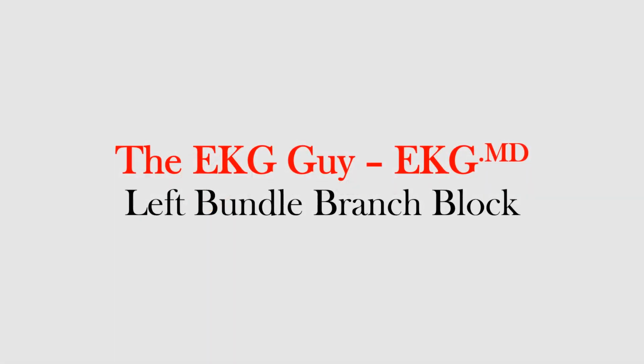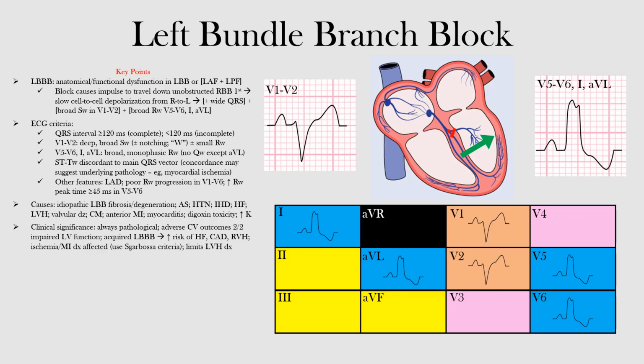In this lecture, we will discuss left bundle branch block, including its pathophysiology, EKG features, potential causes, and clinical significance. If you recall, the normal electrical conduction system of the heart starts with the SA node, or the sinus node, in the upper right atrium. So just to review, here's our sinus node. This is our right atrium here. This would be our left atrium, our right ventricle, and left ventricle.